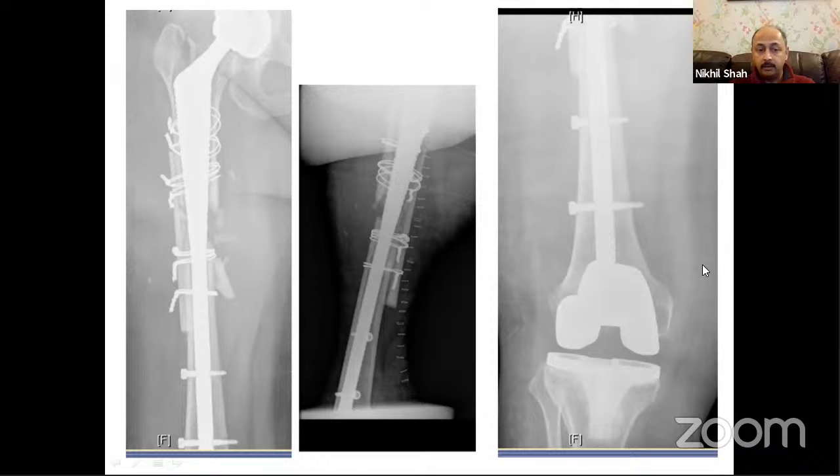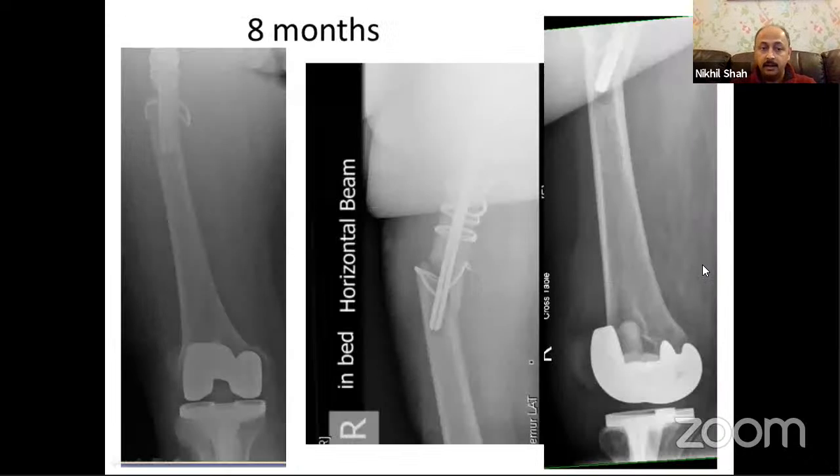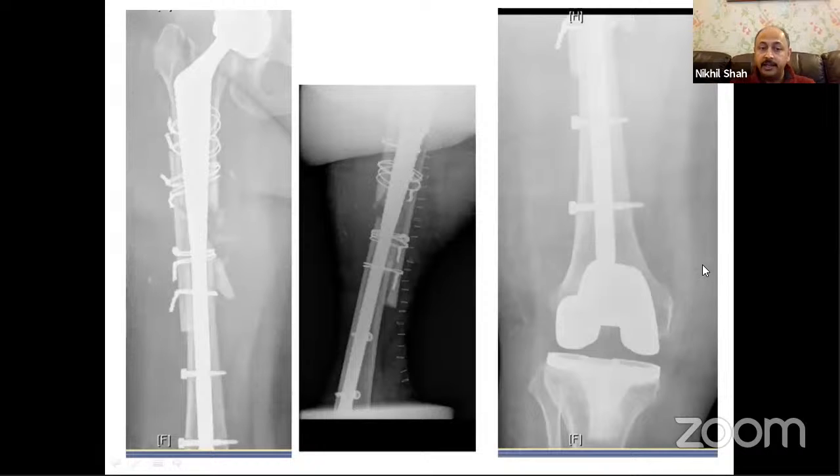When I went in to take out the stem, despite the ETO, the stem was very solidly united medially. So the stem had got very good ingrowth on the medial side. And surprisingly, the ETO was ununited. As soon as I cut the wires, the ETO sprung open. But there was a lot of fragmentation medially in an attempt to take that stem out.